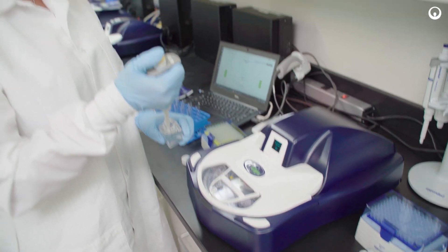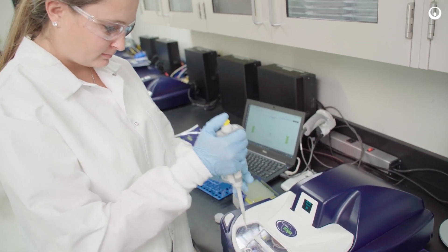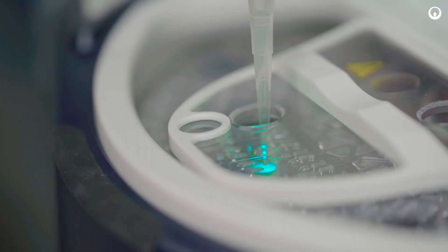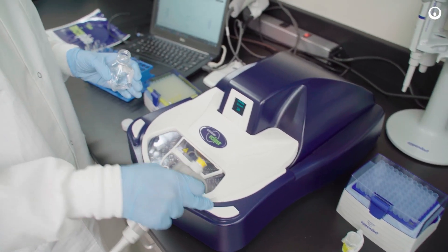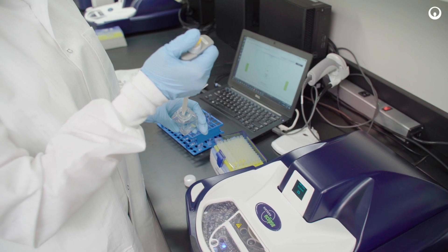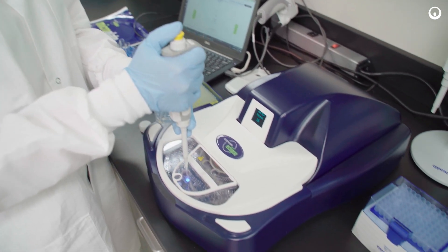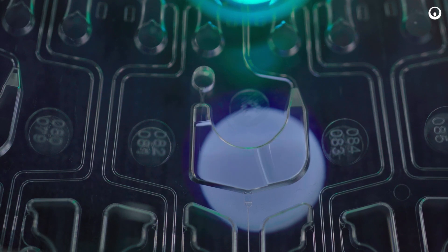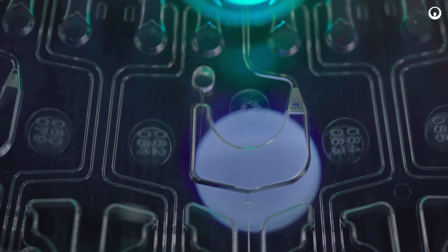We're able to significantly reduce the pipetting steps required to get a fully compliant endotoxin assay started by leveraging microfluidic liquid handling along with embedded endotoxin standards and positive product controls to easily and quickly begin a fully compliant endotoxin assay in as few as 27 pipetting steps to have a fully compliant 21 sample assay.